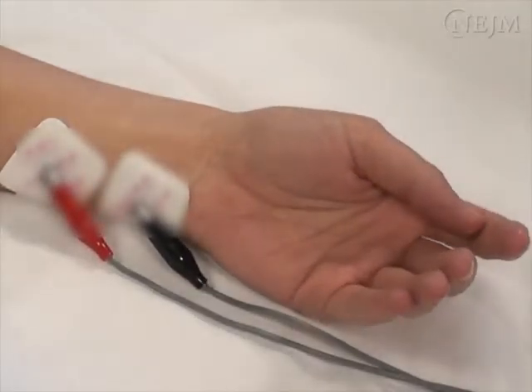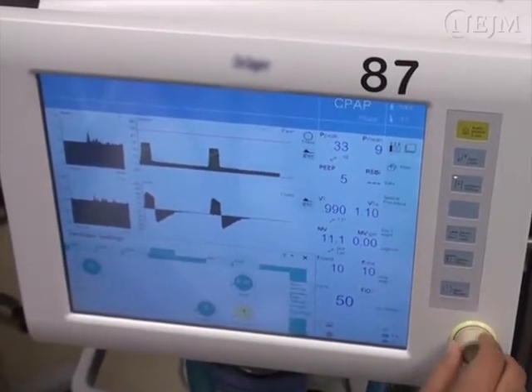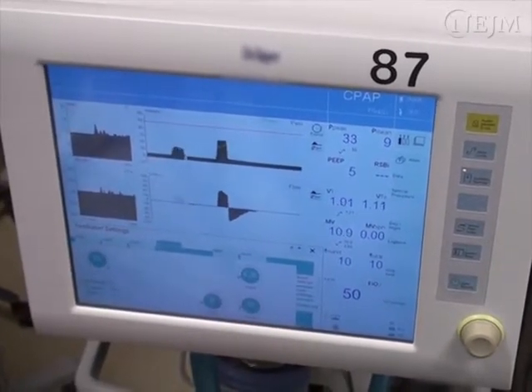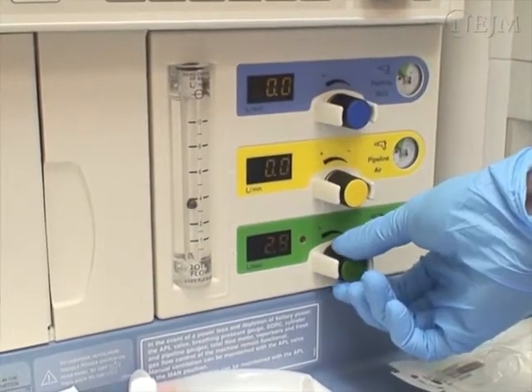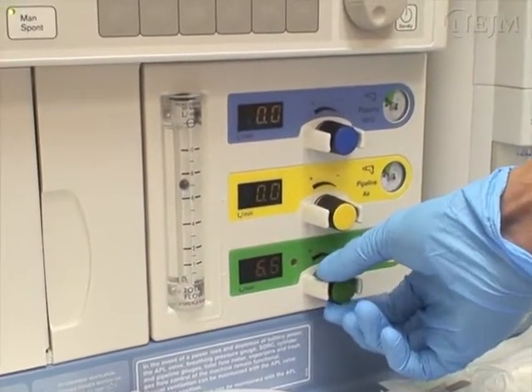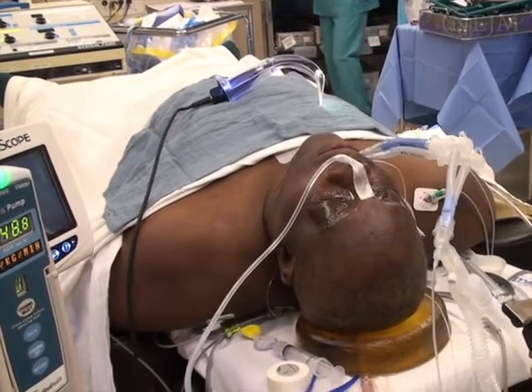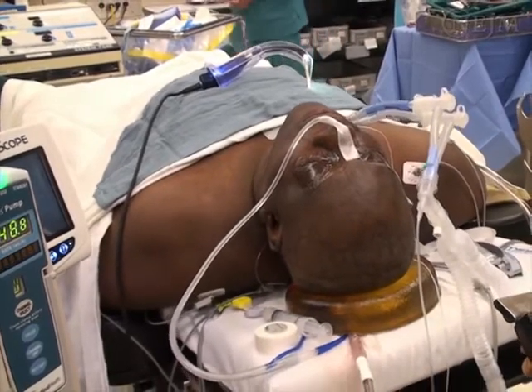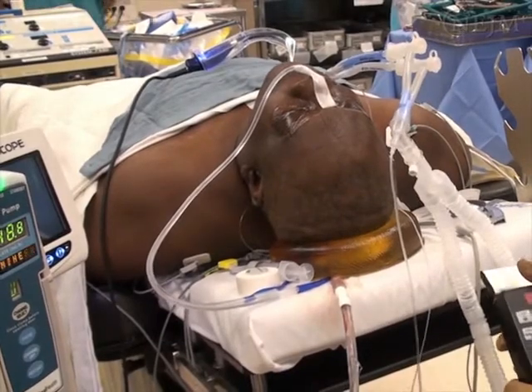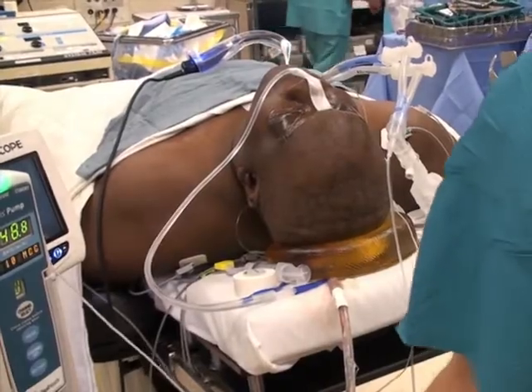If neuromuscular blockade was induced, make sure that the blockade has been fully reversed. In preparation for extubation, adjust the ventilator to ensure that adequate respiratory effort is present with minimal support. Oxygenation should be maximized with 100% inspired oxygen delivered through the breathing circuit. Place the patient in a semi-recumbent position to reduce his or her work of breathing and improve oxygenation. An upright position increases functional residual capacity, allowing for longer periods of apnea before oxygen desaturation occurs.